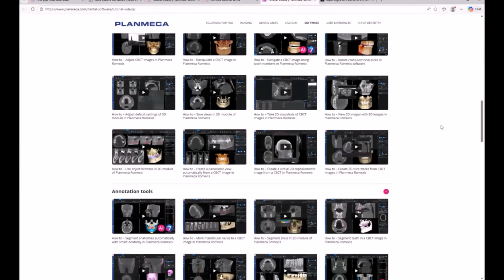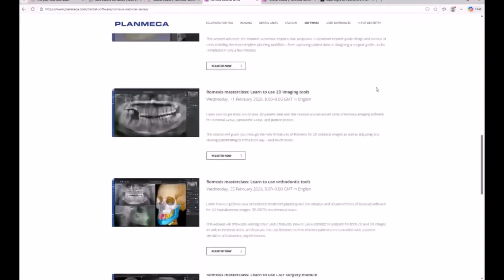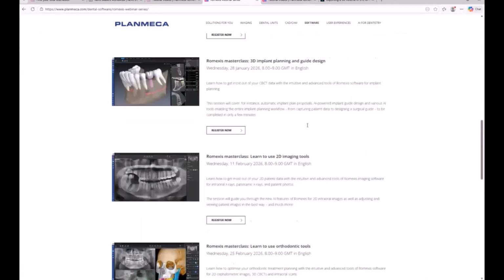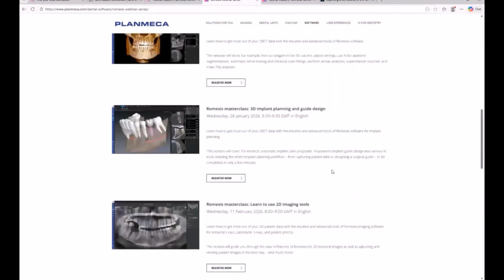Also, the webinar series will continue in 2 weeks. We will have another webinar, and the next one is about 3D implant planning and guide designing. After that, we look into the usage of 2D imaging tools. We also have some nice AI tools for implant planning that I will show. Then the last two are for orthodontic tools, and the last one in March will be on the CMF surgery module. I hope you will be able to join me on those as well.